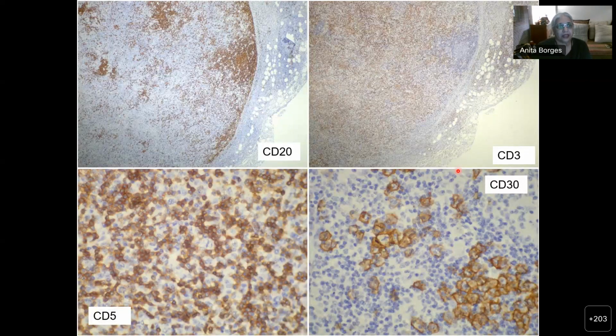Okay, so now let's look at his immunohistochemistry. And what do you see? You see what we saw, no? And that much of what is present in this lymph node is not B. It's all T. Can you see? There are some lymphoid follicles, and you know that this is a lymphoid follicle because, as we showed you in the first immunos that I was showing you, you get a sort of dense periphery and you get a lighter colored center.